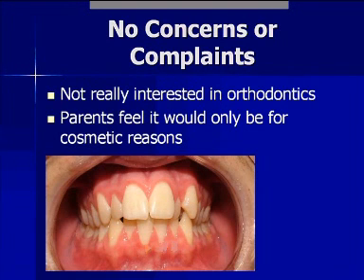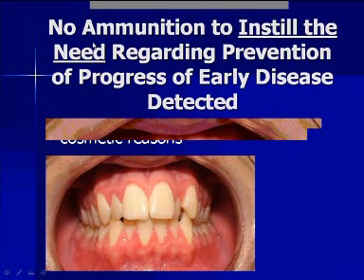Your teeth come together 2,000 times a day when you swallow, so every time your teeth touch, you're going to have traumatic occlusion occurring. When we chew, we have bolus or food between our teeth, so really the traumatic occlusion isn't necessarily occurring when we're eating. It's usually when we're swallowing and we're bringing our teeth together, or if we're a bruxer. So we can use this information to correct the existing problems so that they commit to the treatment.